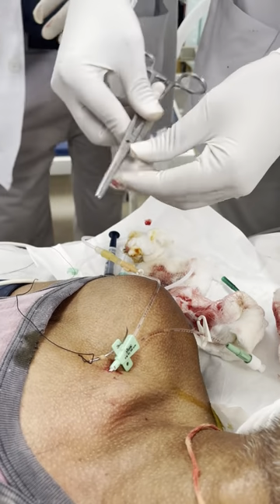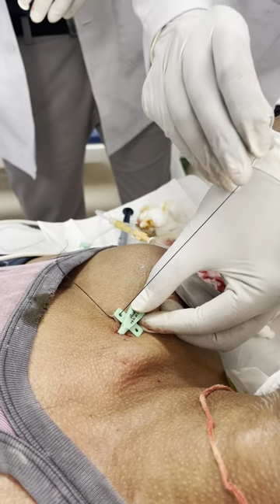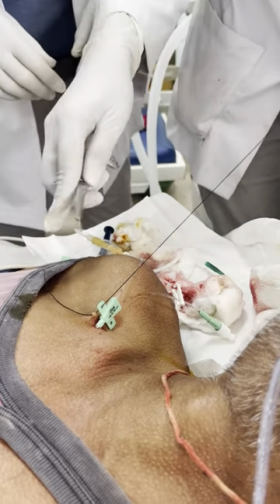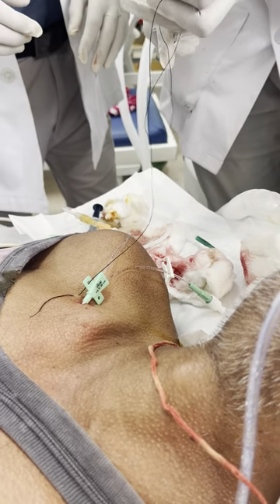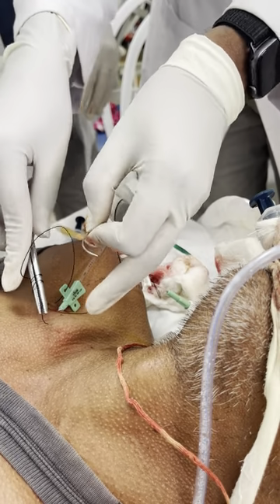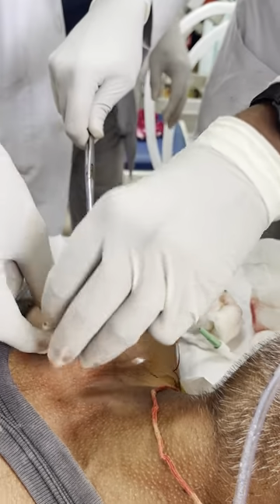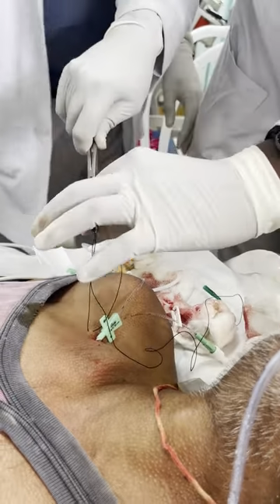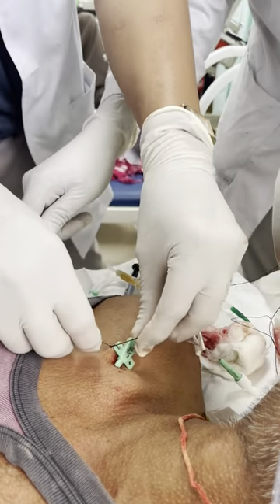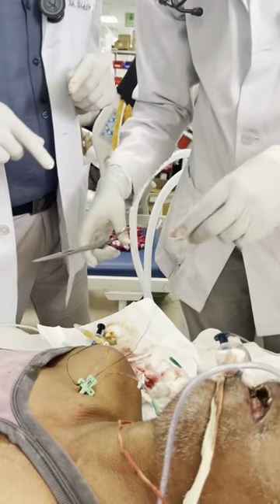Karo. Ab to haath se khech le. Good. Always take care of the cuts and all. Do you need to open this? No, you don't need. 1, 2, 3. First is 3. Now you need this. Don't fear. Hold it here. Leave this. It will give you a bad prick. Leave this here. Now do your job. Good enough. Not yet good enough. Like this. Okay. Give one more stitch. This time we only need one.